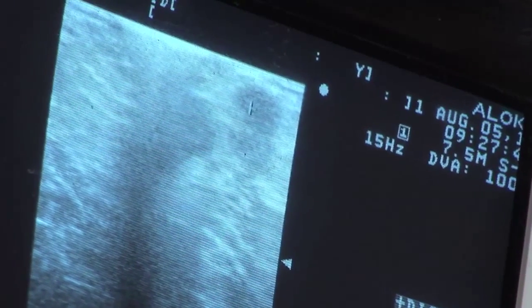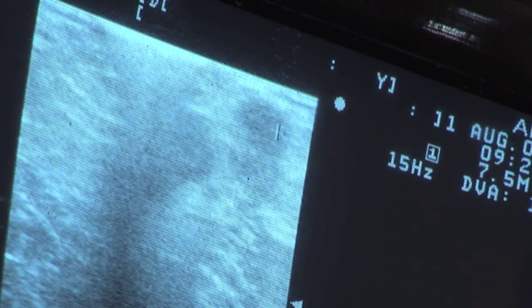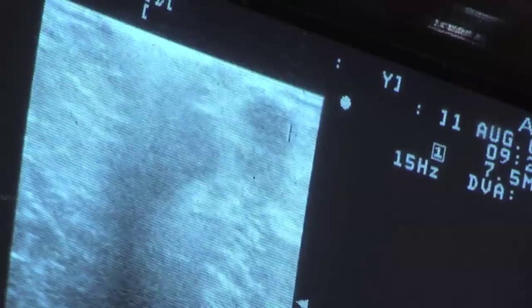There are probably numerous very small follicles in here. If you really look closely, you can see some very small, darker areas that would probably represent, there's one right there, young, developing follicles. I would not consider those to be large follicles that are actually going through any kind of follicular development or follicular waves or something like that.